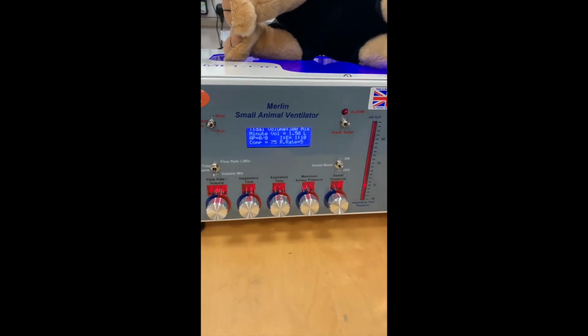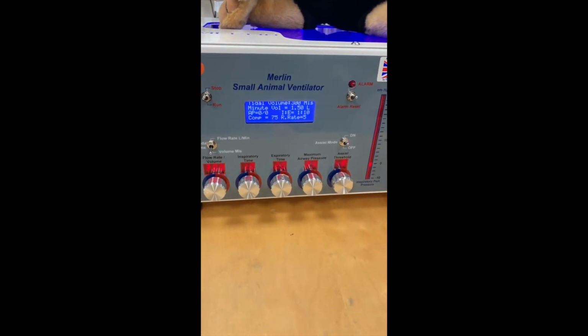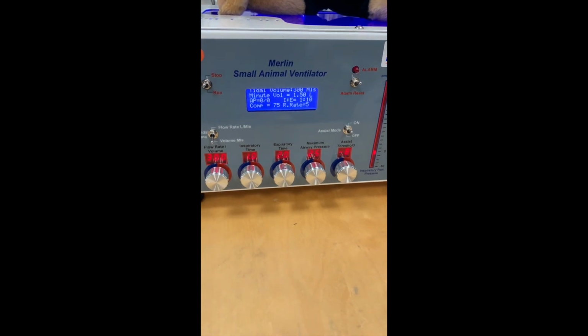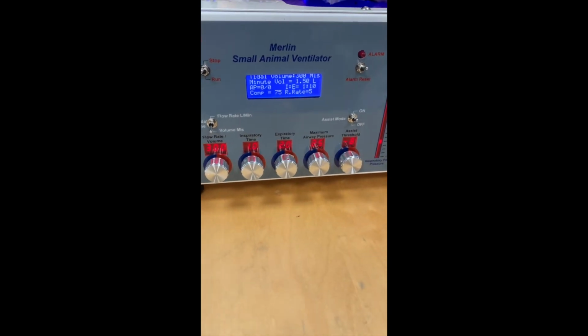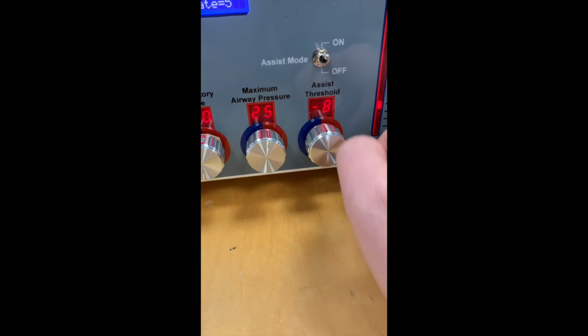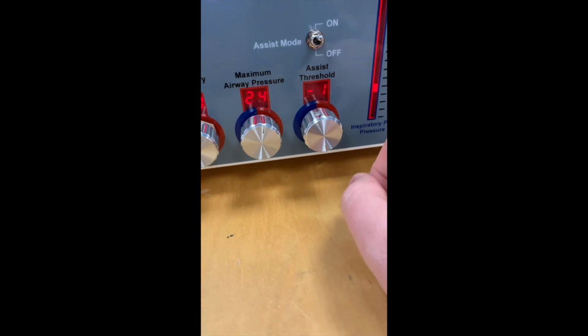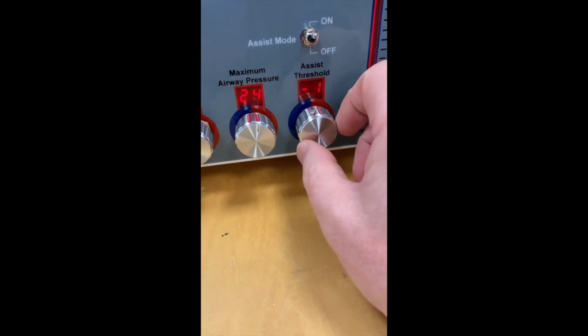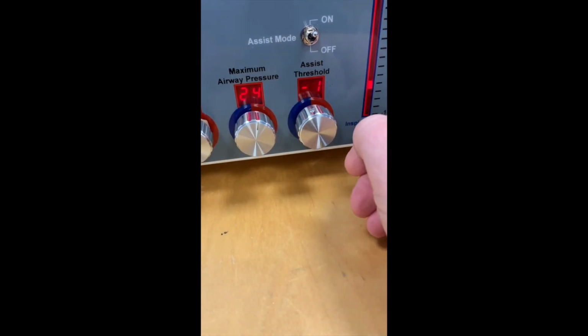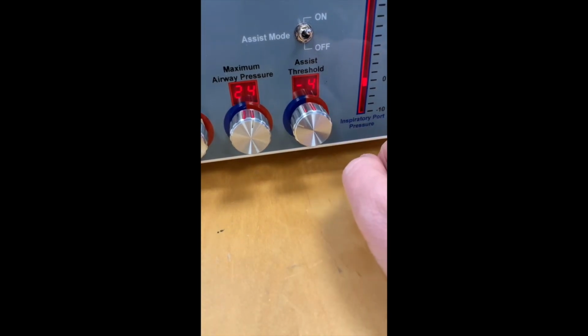And now I want to look at the assist mode function and ability of Merlin. This is a simple assist mechanism that's triggered by a negative pressure in the patient airway. So when the assist mode is set to on, it's possible to set a trigger threshold in centimetres of water between -8 and -1 centimetre of water. So -1 centimetre of water trigger threshold is very low, and even a tiny inspiratory effort would be sufficient to trigger this. As the patient gets stronger, for example weaning from an anaesthetic or from a ventilator, increasing the assist threshold changes the effort required to trigger the breath.